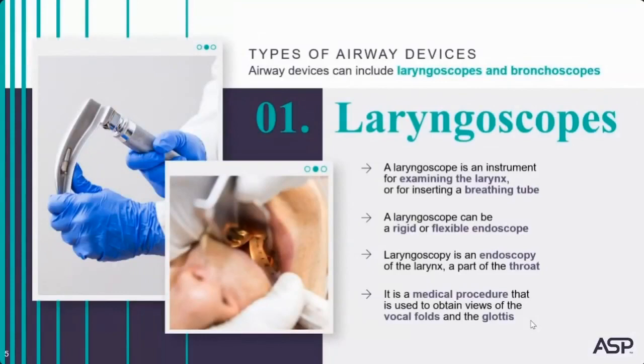When we talk about airway devices, you might think about COVID-19, ICUs, and respirators. But while airway devices can assist with life-saving measures, they are used for a variety of procedures in assisting with the diagnosis, treatment, and maintenance of airways.